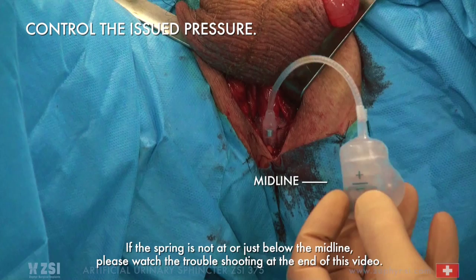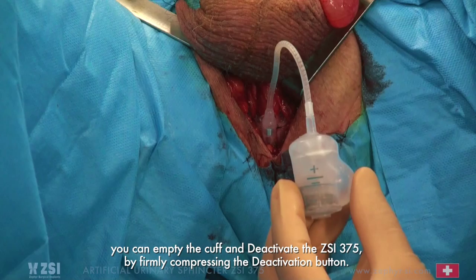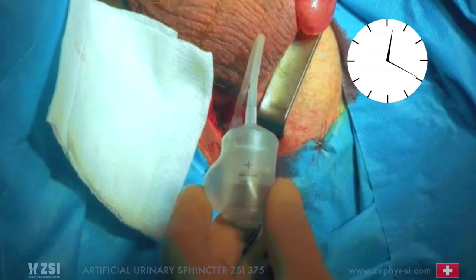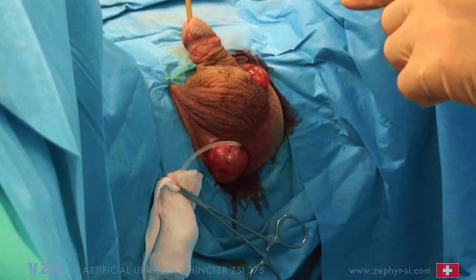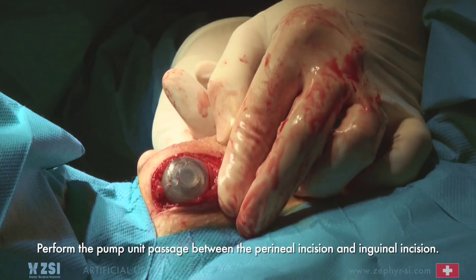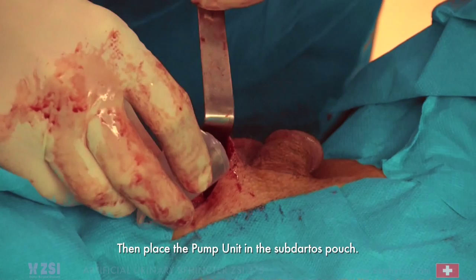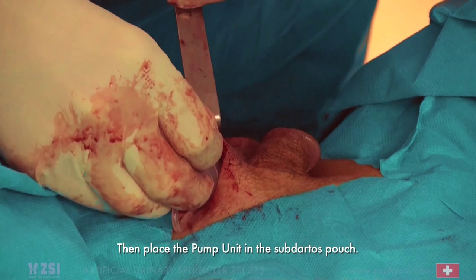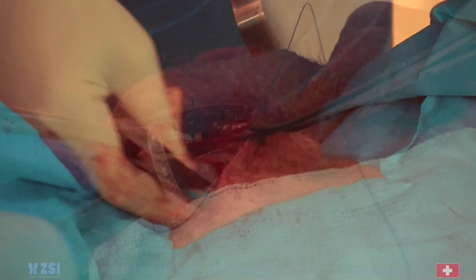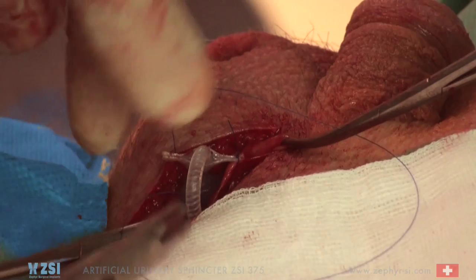After confirming that the spring is in the midline position or just below, you can empty the cuff and deactivate the ZSI-375 by firmly compressing the deactivation button. Install a size 12 Foley catheter for 24 hours. Perform the pump unit passage between the perineal incision and the inguinal incision, then place the pump unit in the subdartos pouch. Suture the wings of the butterfly to the internal scrotal tissue to avoid rotation of the pump unit. Turn the septum sideways to the urethra and confirm the cuff pillow is properly installed.